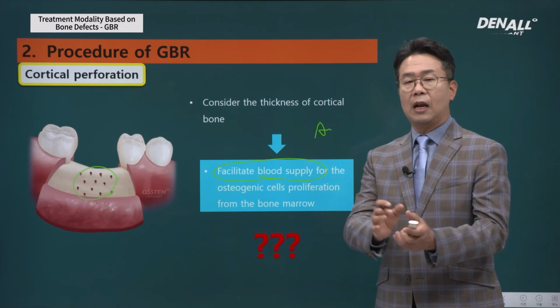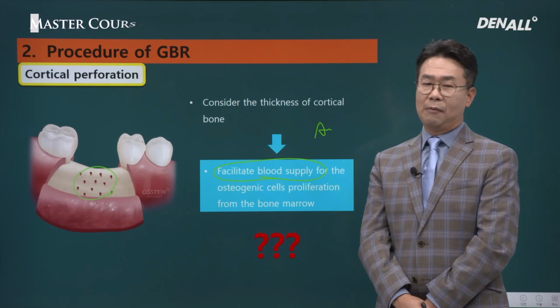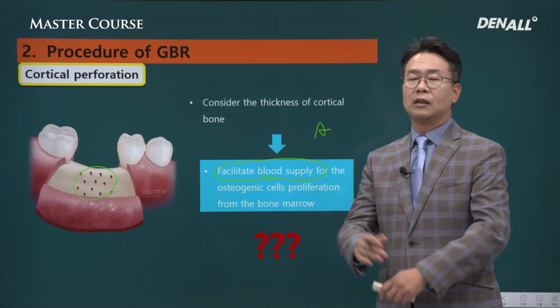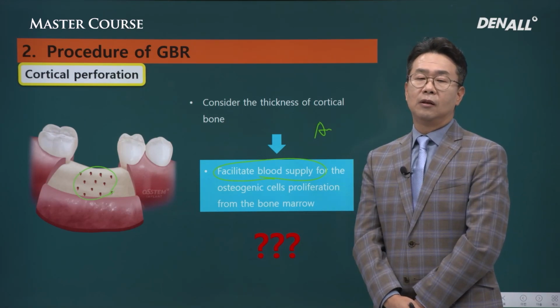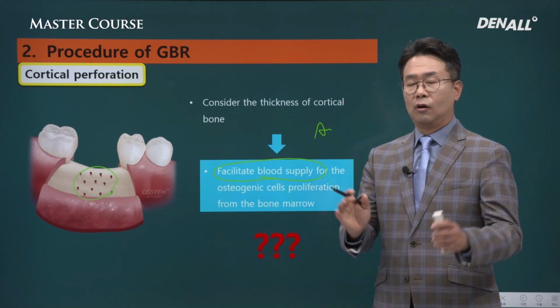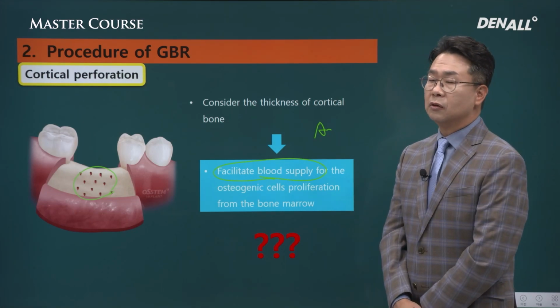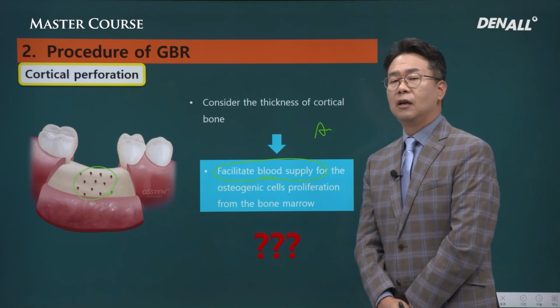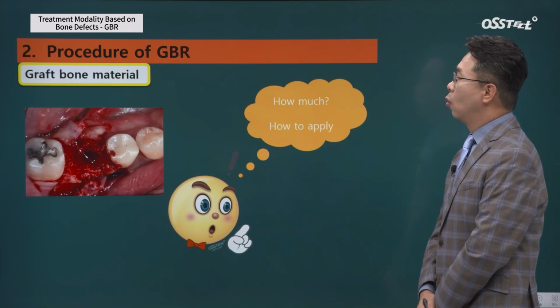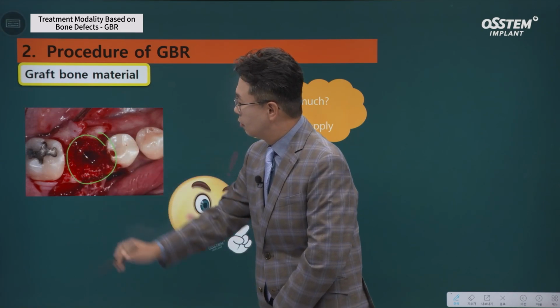You can really tell the difference in terms of stability when you compare between mixing bone graft materials with saline and mixing bone graft materials with blood. I'm sure you'll be able to get a sense of which is better in terms of manageability when mixing bone graft material with something and doing without. In that sense, if the clinical situation is not unfavorable, a perforation may be a good choice. Then you do bone graft accordingly. You can see if bone graft has been applied here.